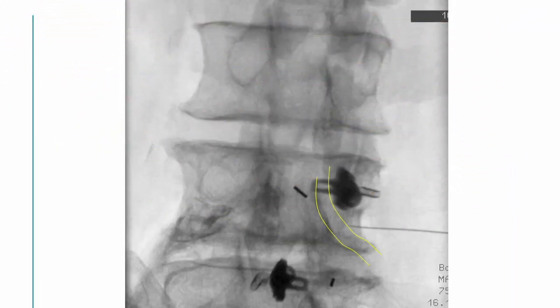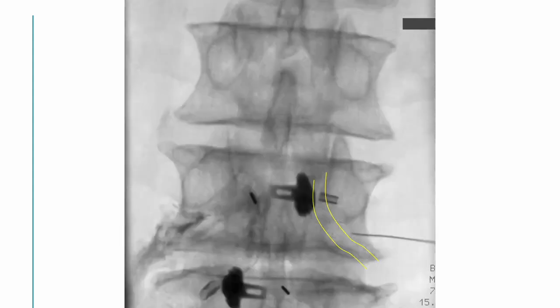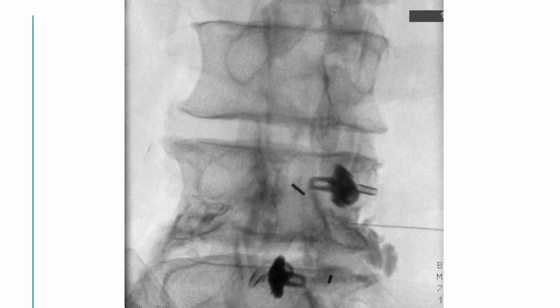It is a contralateral oblique image. I can draw an imaginary line over the nerve root in the contralateral oblique view and the AP view, and then slowly infiltrate contrast to confirm the suitable space and observe the contrast spread while asking the patient about their feeling.